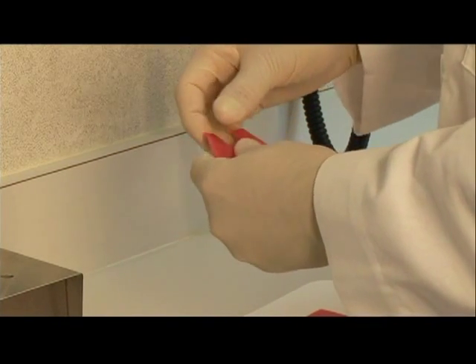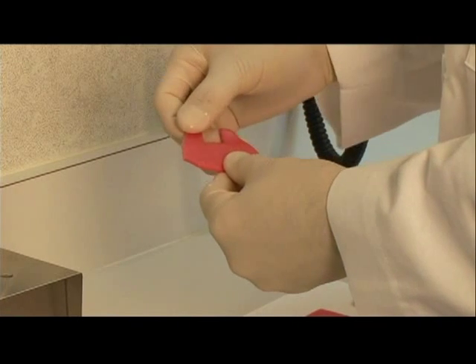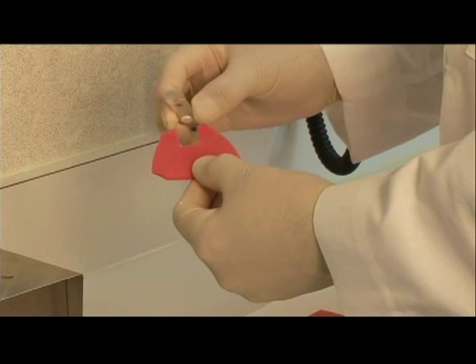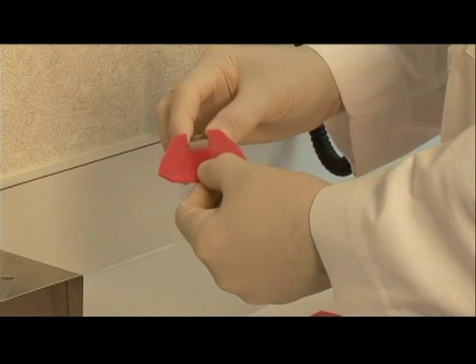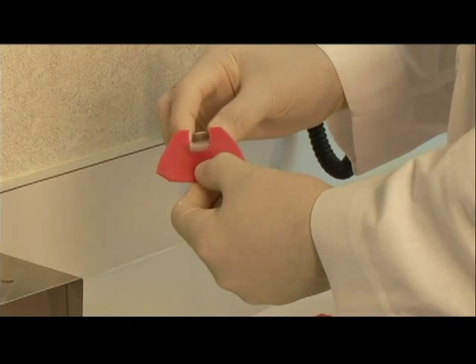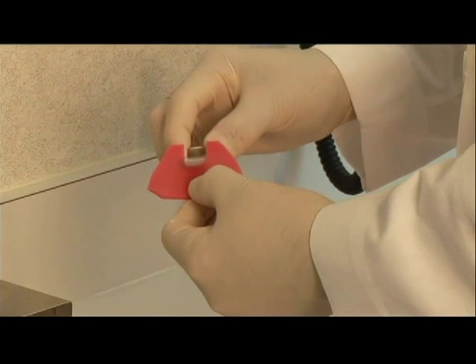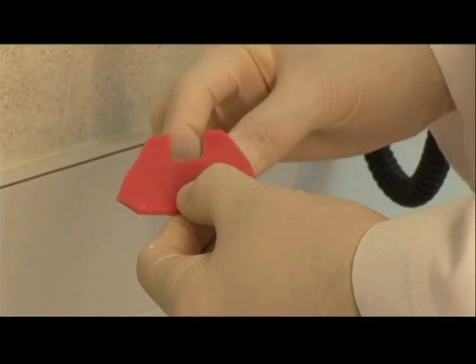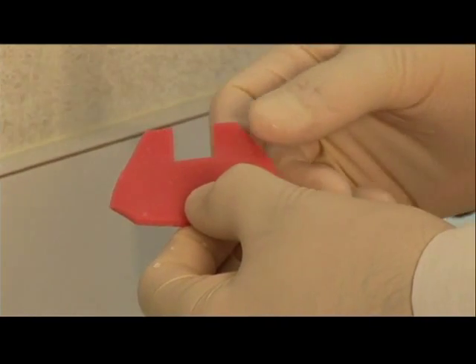Once it is cut, it's positioned in this manner. This will allow a positioning of the interocclusal record deprogramming device to be able to be used, as you see the leaf gauge in place here. Again, this can also be used with an anterior deprogrammer.